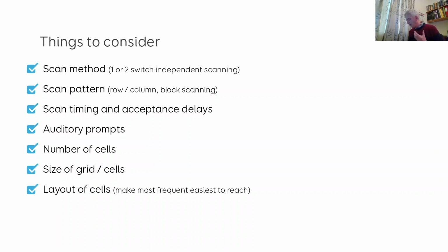So just some things there to consider as you're thinking about your switch access. One thing always to bear in mind is a clinician is always recommended when you're thinking about switch access. The presence of a physio or an OT or an AAC specialist can be really helpful. Their knowledge and experience, not just of positioning, but some of the fine tuning that's required, can make all the difference. And making sure that you are helping, not hindering, someone's fatigue, as well as efficiency and comfort, for example.